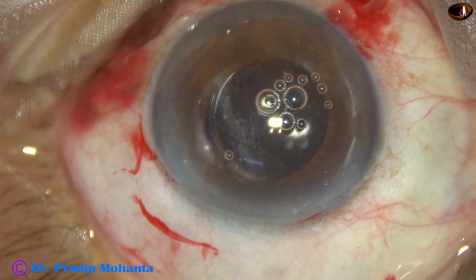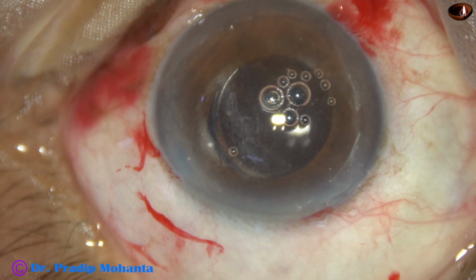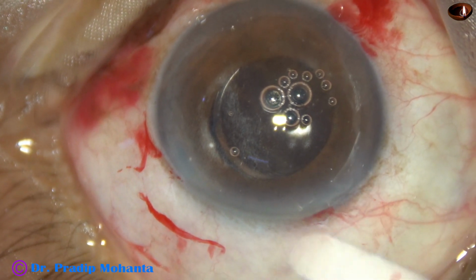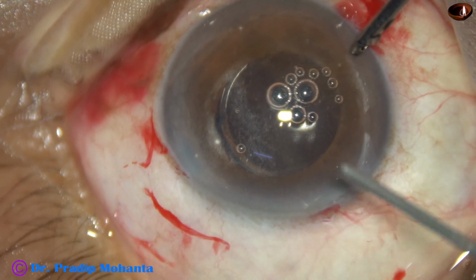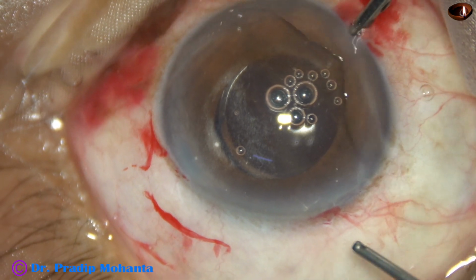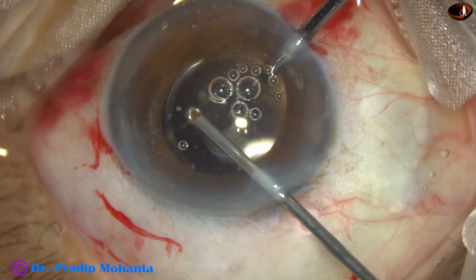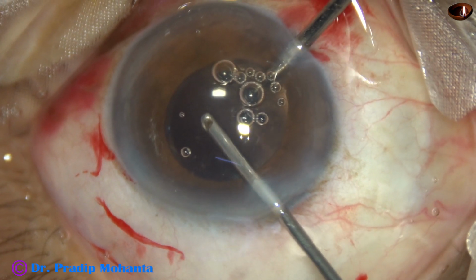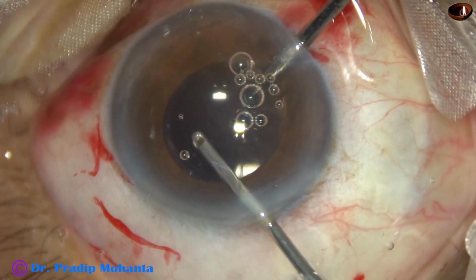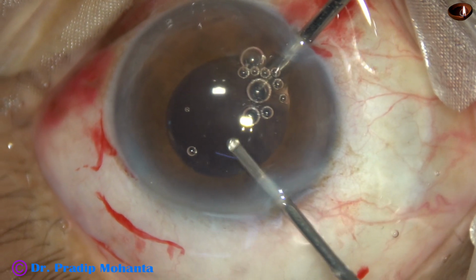So, vitrectomy has to be done, and already I have asked for the vitrectomy cutter. Cutting rate is 3000 cuts per minute, flow rate is 20 and vacuum is 200, and this is the trimming of vitreous strands. Irrigation is through the 8 o'clock side port and the cutter is being used through the main wound.